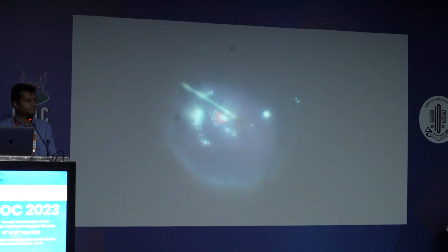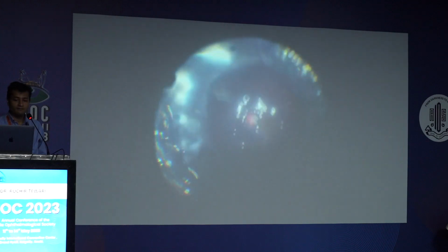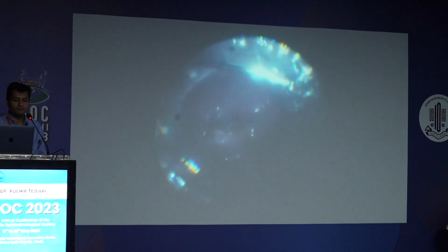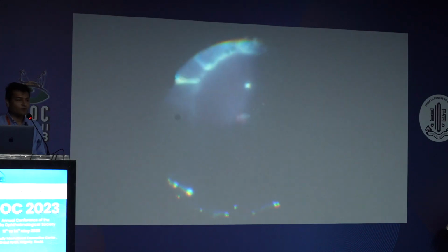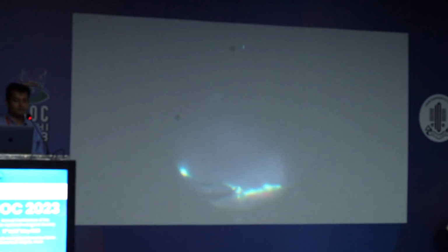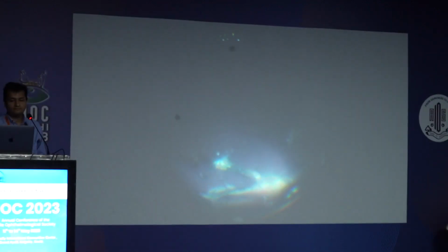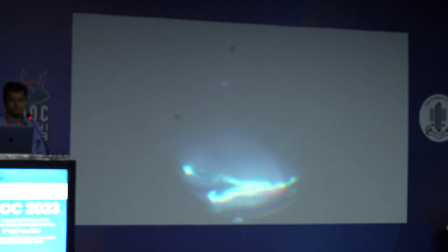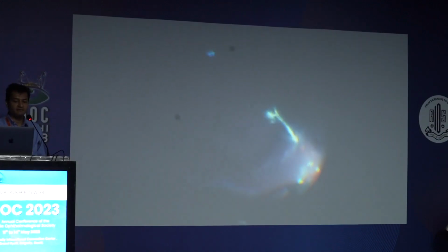Was the pars plana detached also? Sir, the pars plana also was detached? Yes, sir. So then some anterior vitrectomy is done under air as well. And after making a small retinotomy, air fluid exchange is completed. At the end of the surgery, the anterior retina seems taut, so cautery is done to release traction. This is followed by 360 barrage laser.